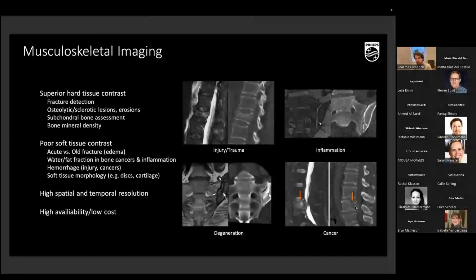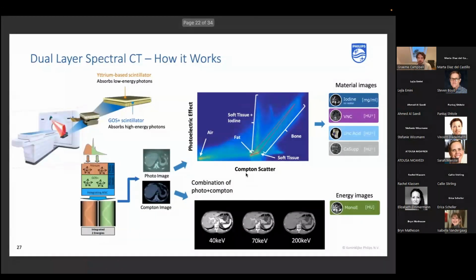Cancer as well, osteolytic lesions, osteoblastic lesions, these are what's looked for to diagnose, for example, bone metastases, multiple myeloma, but sometimes we don't see those. If there's a suspicion of multiple myeloma, and we don't really see lytic lesions, or maybe we're not quite sure, then to determine if we're in a pre-myeloma stage, do we see changes in the bone marrow composition? And for that, at the moment, we would need something like MRI.